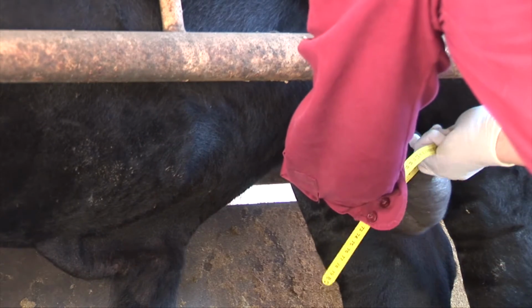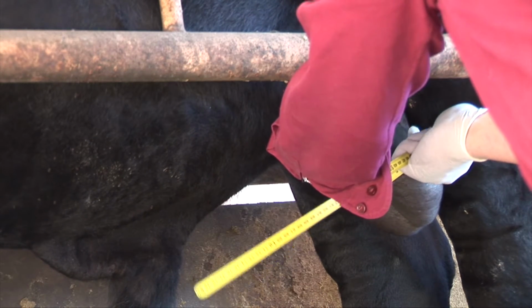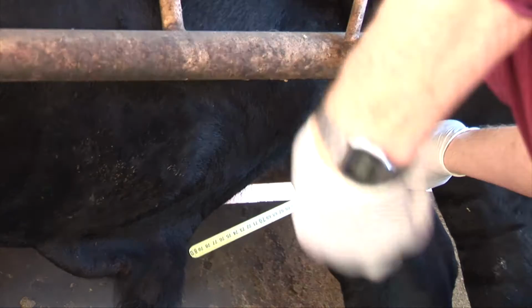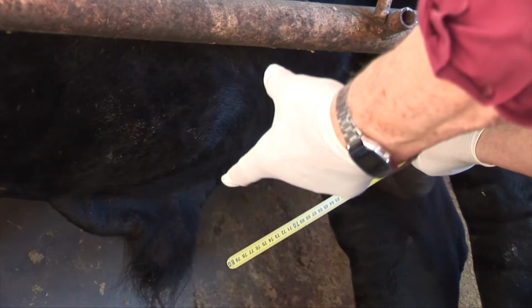Okay, so then I put the scrotal tape around the largest part of the testicle. Make sure I'm not pulling it too tight, but neither too loose. So again, I'm going to have to move my hand a little bit to show you what I'm doing. But it's very important that that testicle is down, forced down into that scrotum, the same with every bull.